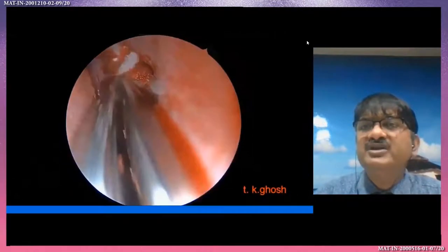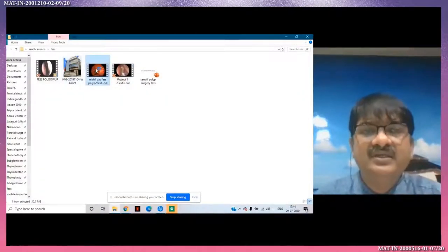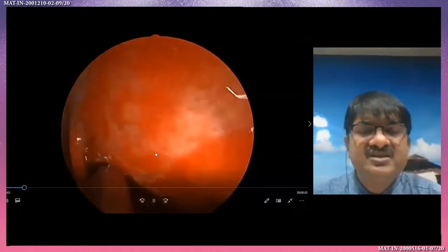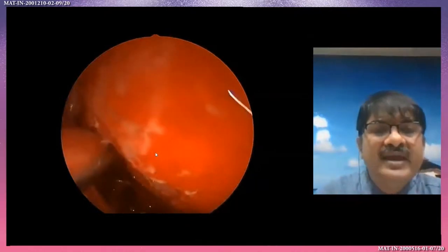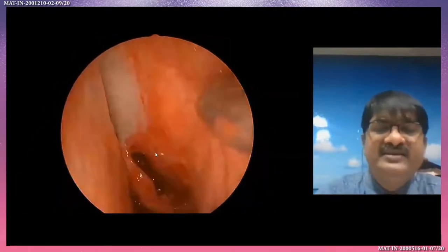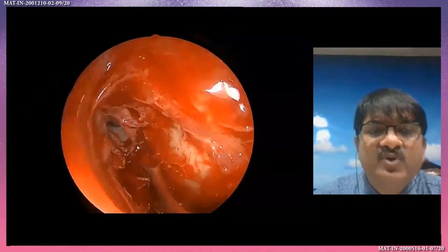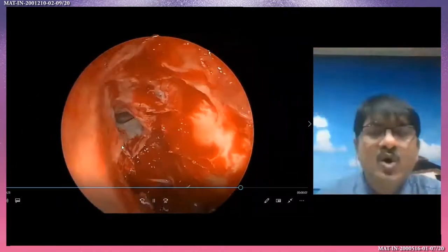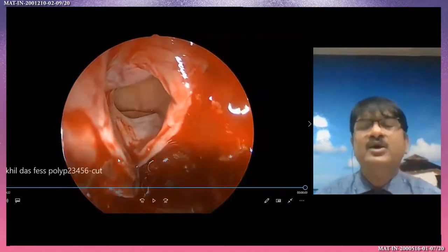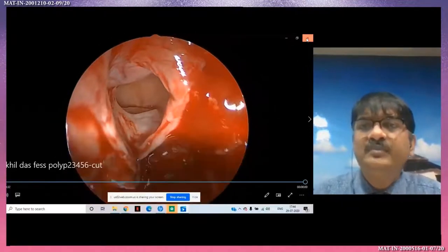Now I will show only the frontal sinus opening — how we preserve the epithelium. Because sometimes during frontal sinus surgery, if you remove and pull all epithelium, the frontal sinus epithelium will be removed and there is a chance of frontal stenosis. To avoid this, all the time just maintain this way to protect the epithelium. Here is the frontal sinus epithelium — if you remove all there is a chance of stenosis in the future. So just protect it and with the microdebrider just help with no direct trauma to the epithelium.